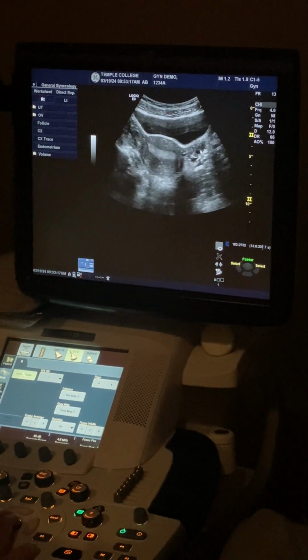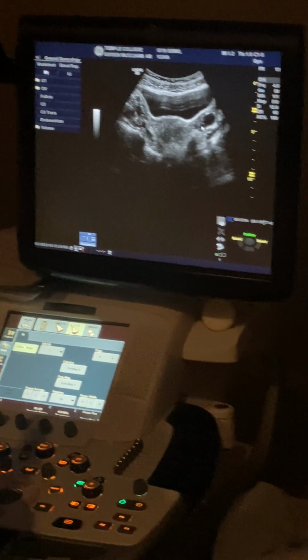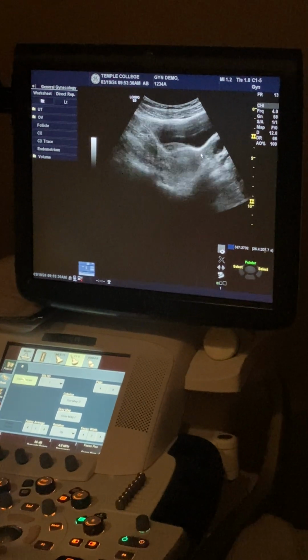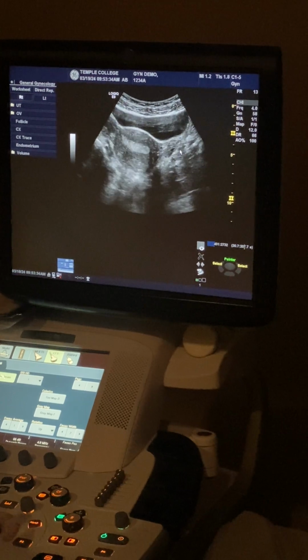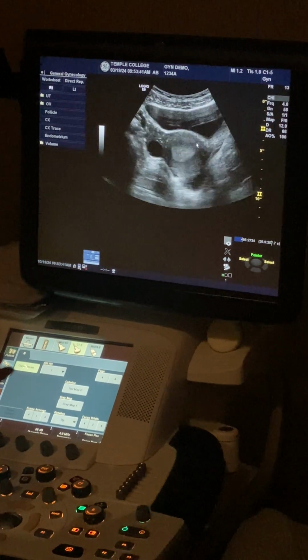And then this side, there's that tube and it comes up and kind of wraps. You watch football players and they tuck that ball under like that. That's what they're doing with the ovary. It's tucked. So you can see the tube sometimes, but you'll always be able to at least see a point of reference to get to the area where the ovaries are. Does everybody make sense of that?